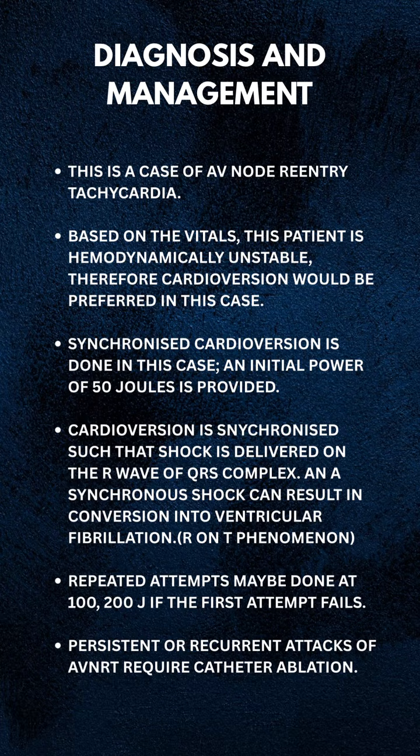Now cardioversion is synchronized such that the shock is delivered on the R wave. This is done because at this point the entire myocardium is in a refractory state. An asynchronous shock can result in conversion into ventricular fibrillation that is known as R on T phenomenon.